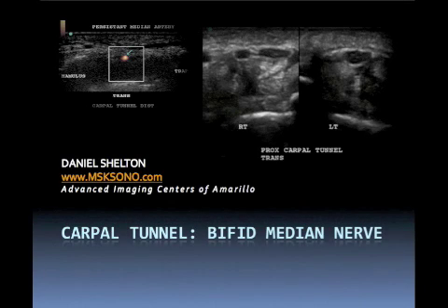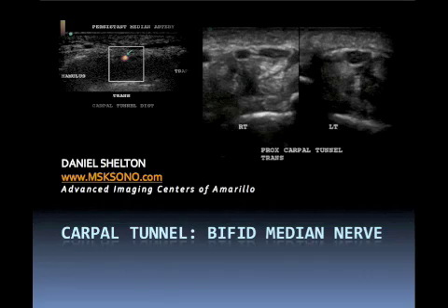The following are case studies of the carpal tunnel, also including a bifid median nerve as well as median nerve compression.